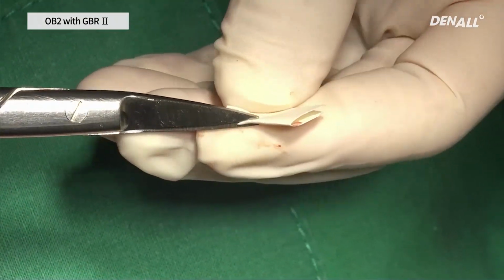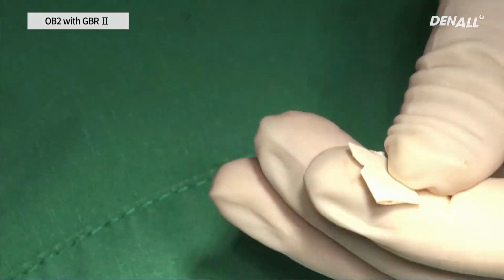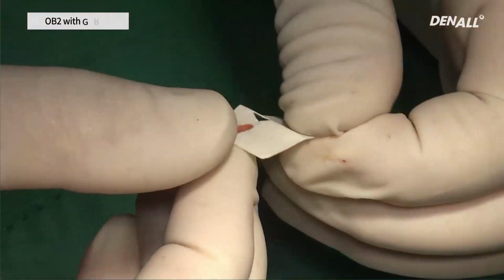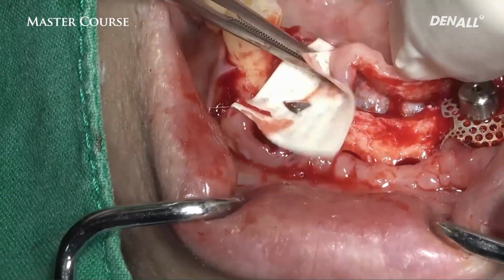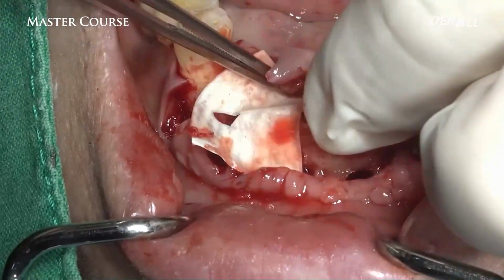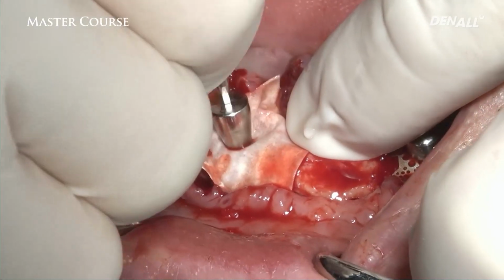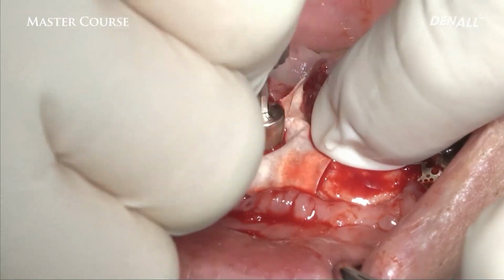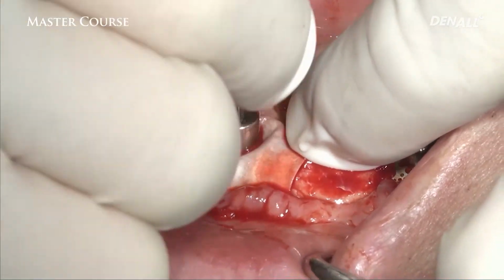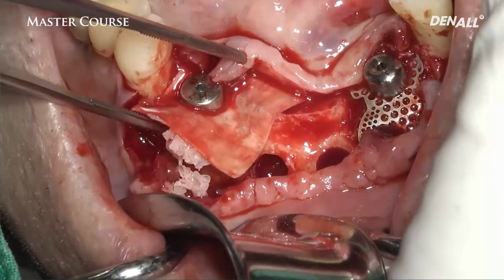On the right side, the defect size was not that big and it was placed sufficiently within the bone envelope. And I used a resorbable membrane called Ossguide. I formed a hole like this, and this is where the healing abutment is going to be connected. Before bone graft is going to be done, Ossguide is fixated on the implant using healing abutment.